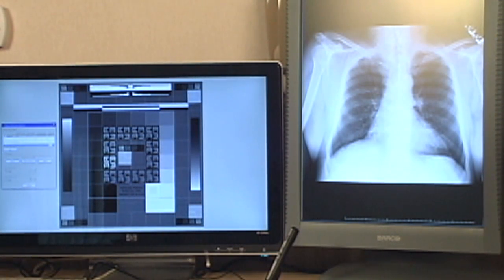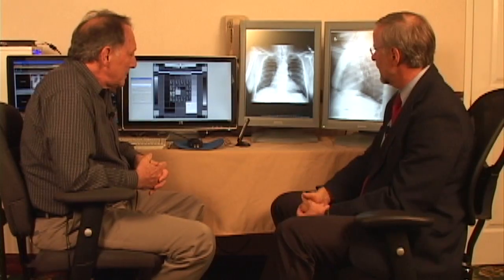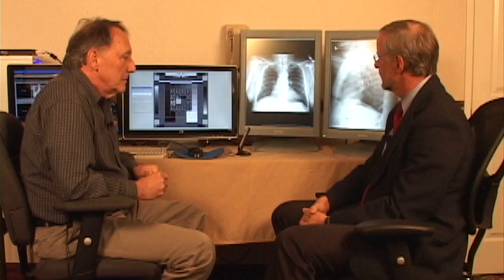Okay, great. So, Ken, sometimes I see questions on those scopes, and maybe some people ask me directly, how long would those monitors last? And when would it, and how would I find out when I would replace them? Sure.